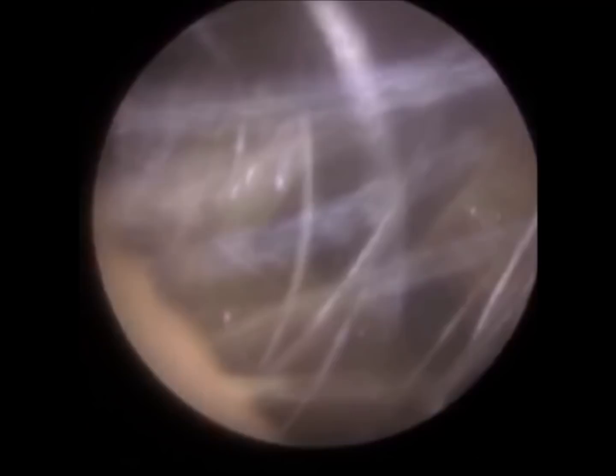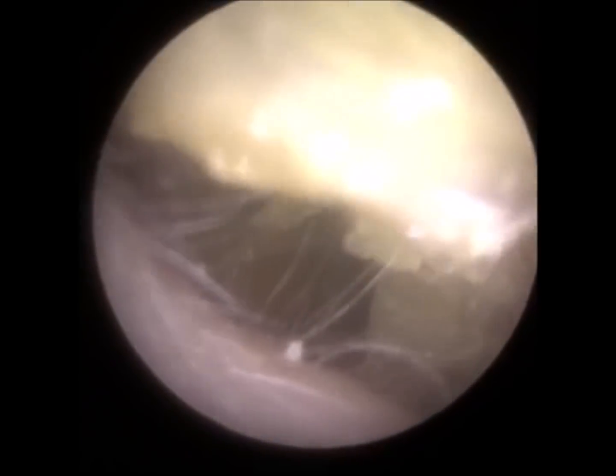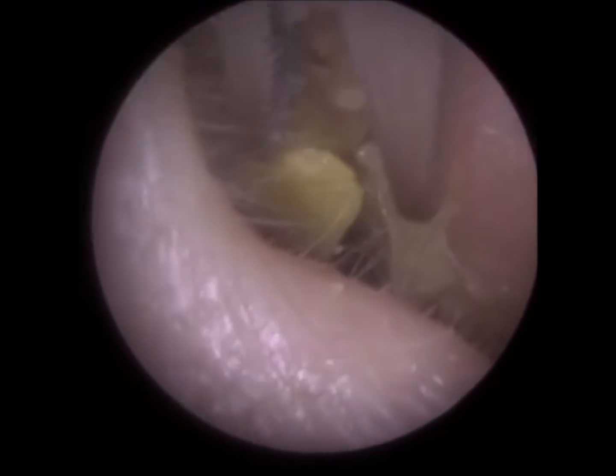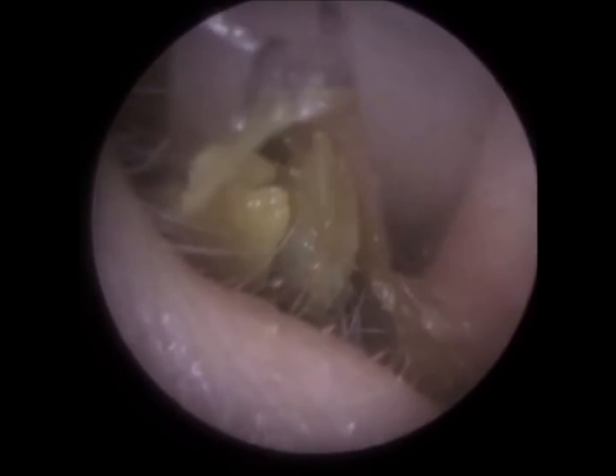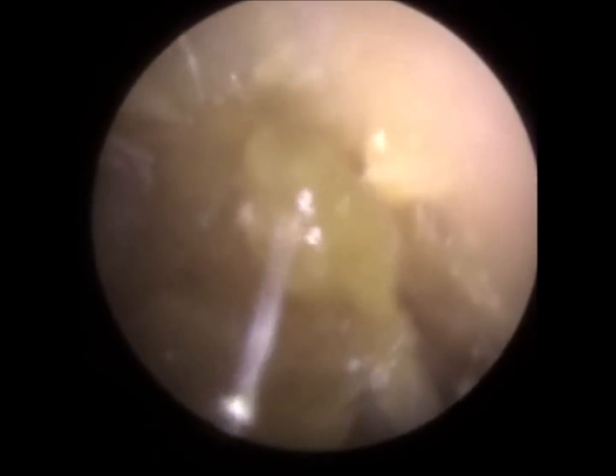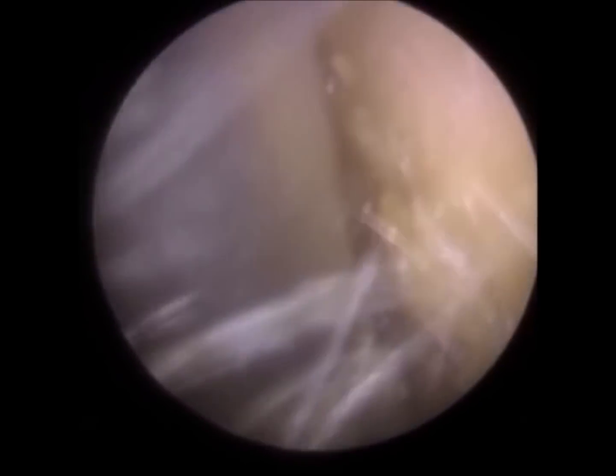So that's an example there of the crocodile forceps not being as effective as I was hoping. But I've just gone a bit deeper, and again, that's just a single ribbon of dead keratin, and there must have been hundreds altogether. So I managed to grip a few there. It's a few layers of dead keratin that came out. So at this stage, the forceps are working quite well. There, it's only a couple of ribbons. So I've just gone back with the suction probe.